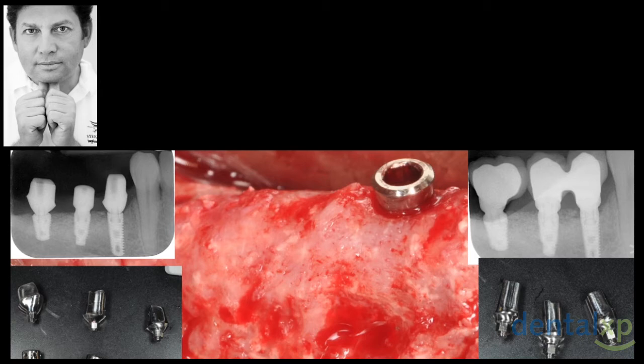I took an X-ray with a regular contour healing abutment to show him the difference. The right abutment will compress my soft tissue. According to Linkevicius, we need 2 millimeters. We published a paper with Thomas Linkevicius. We showed that we need 2 millimeters in order to make platform switching work. This is bad. This will induce initial bone resorption after this huge vertical augmentation. So digitally induced disease today is a problem.